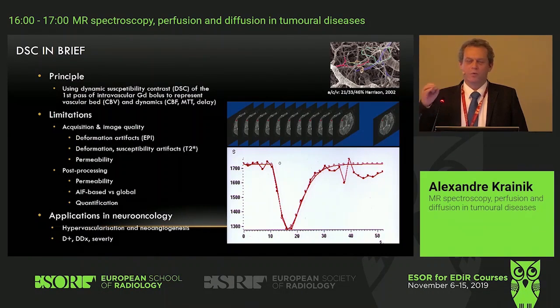Then in one voxel, you have a certain percentage which is related to blood vessels with circulating blood. You must have an idea that about 4% of the brain parenchyma is occupied by brain vessels. 4%.